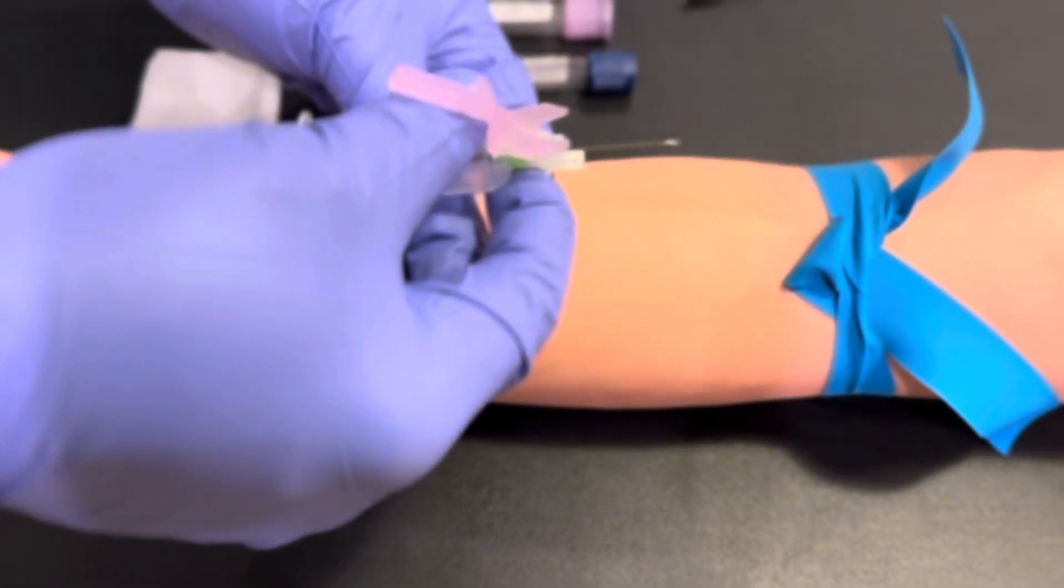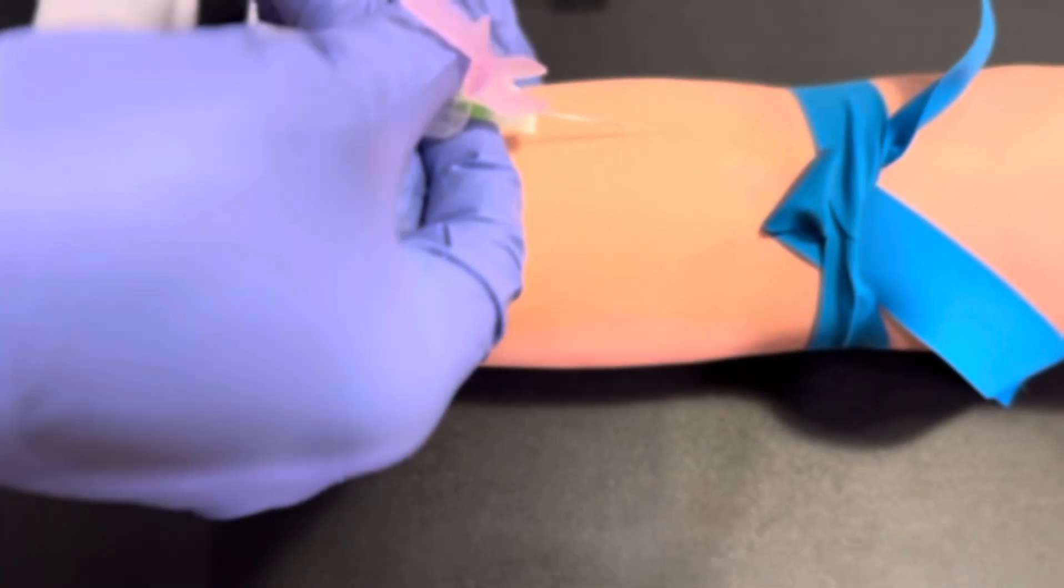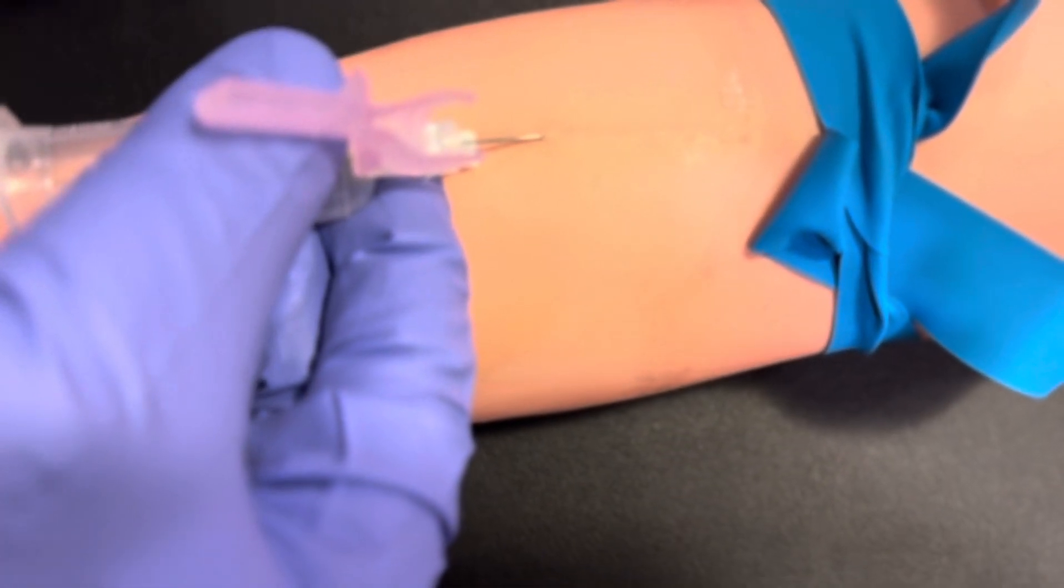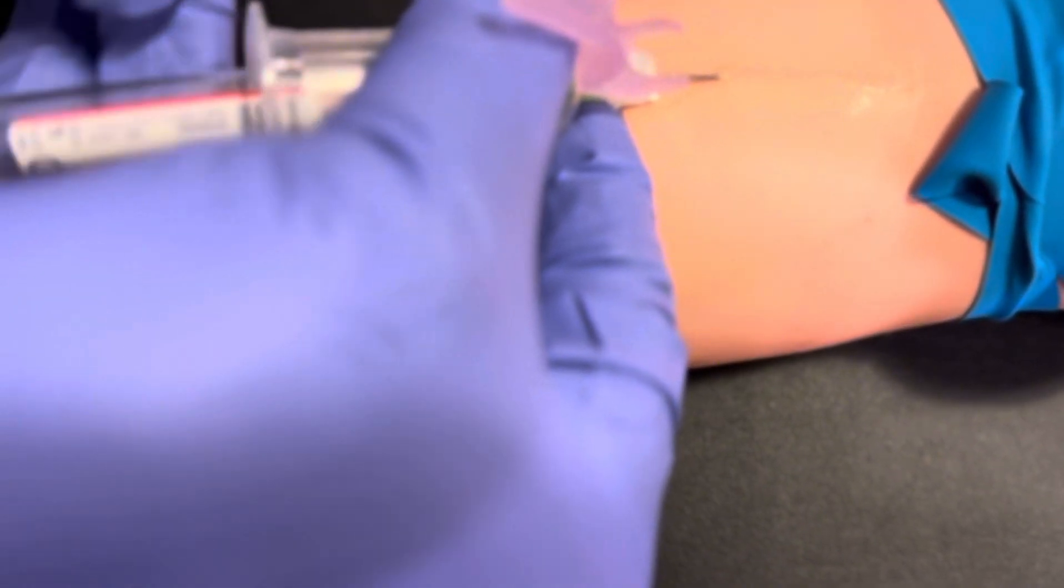Uncap the straight needle. Perform the venipuncture at a 15 to 30 degree angle of insertion and ensure that the needle is stabilized.